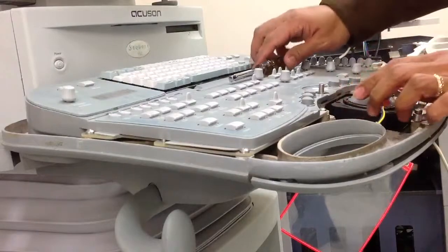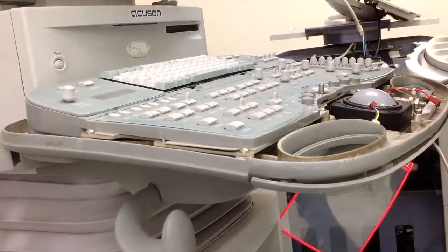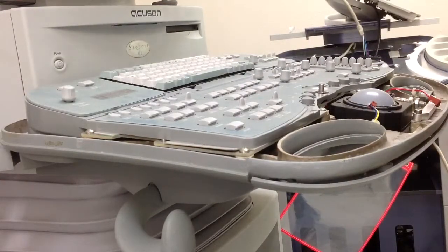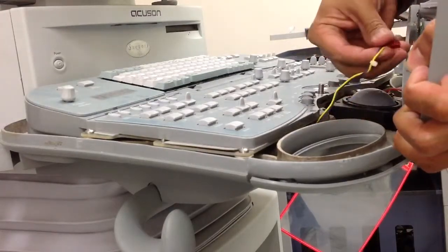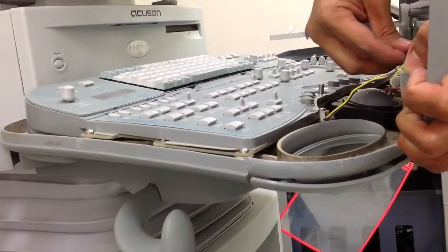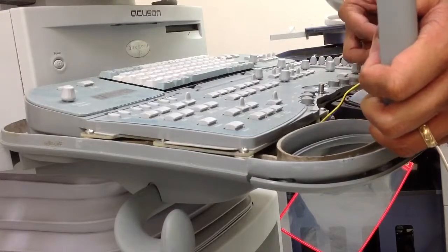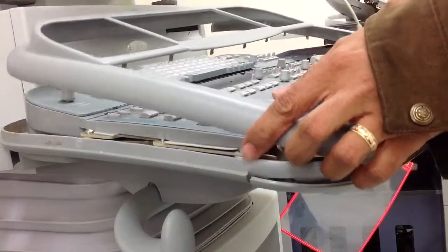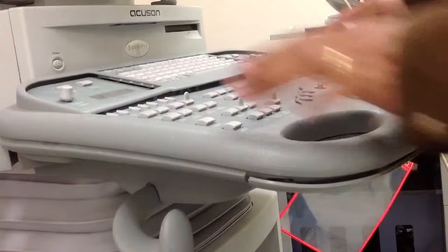Okay, and now next thing to do is the keyboard bezel. Make sure you connect the cable that goes to the left kidney key or set key, and also the right cable that goes to the right set key. Once you've done that, you can put back your keyboard bezel.